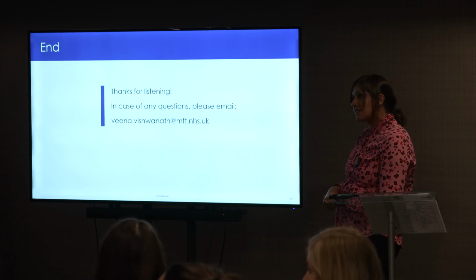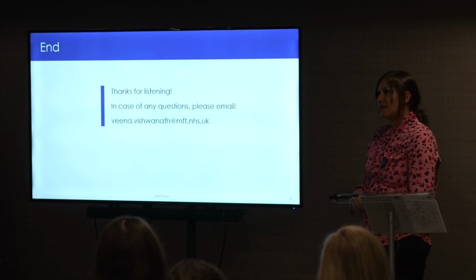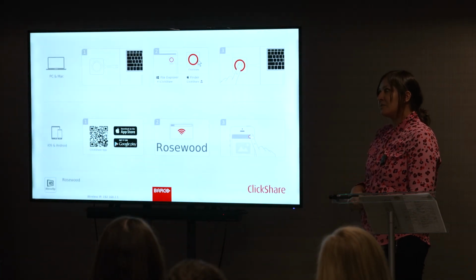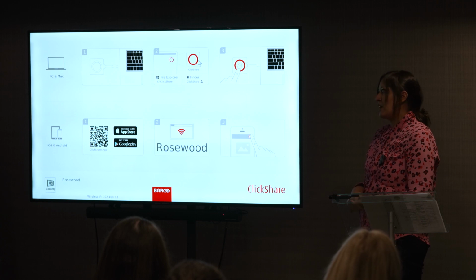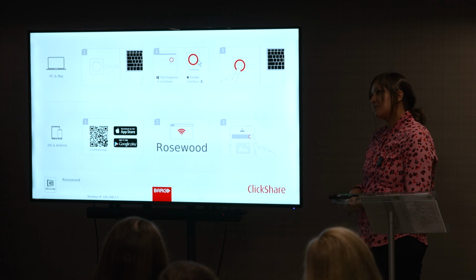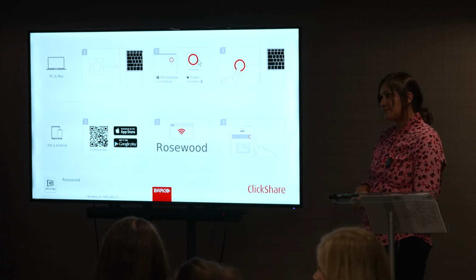As an incidental, so I don't do FNA. So yeah, often me and Michael get sonographers come to us with queries, and the good thing with our PACS system is we have a chat function where they can send a link to the lymph node. What I would say though, is that dynamic assessment is the best way. So I would grab someone to just have a scan as well if you can, and if you're not sure, I would just recall it for a head and neck list because yeah, they can be very difficult. What kind of urgency? A 2 week wait urgency for anything really, because I think you can just never be 100%.